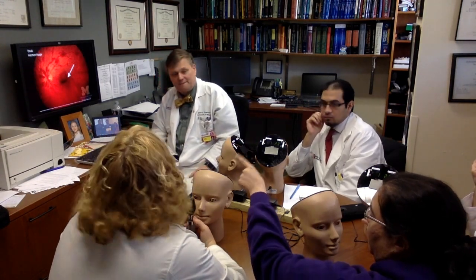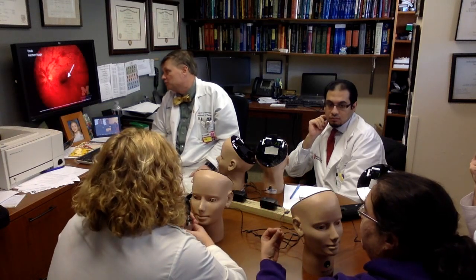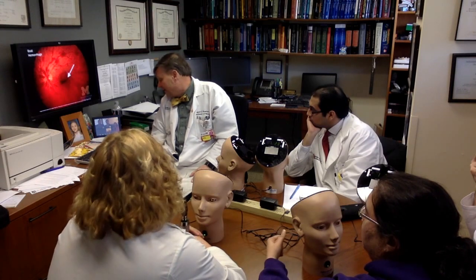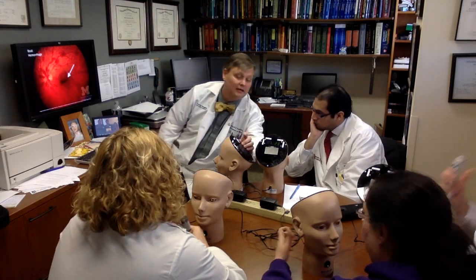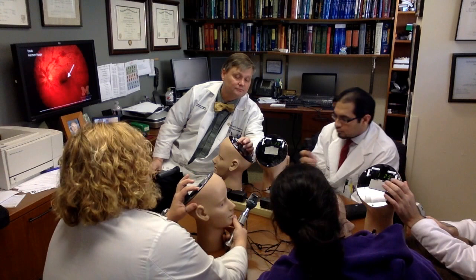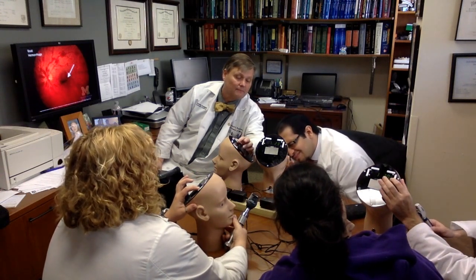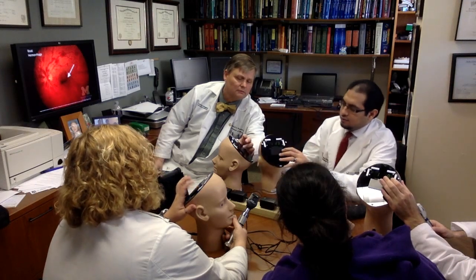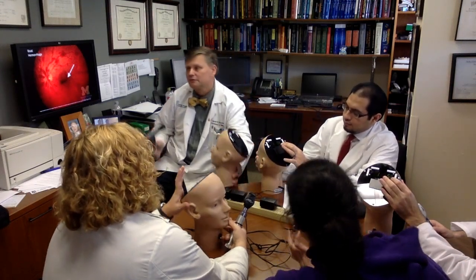So why is this all of them? This one's probably venous? This is probably trauma, actually. This is probably trauma. All right, now let's go to number 3.